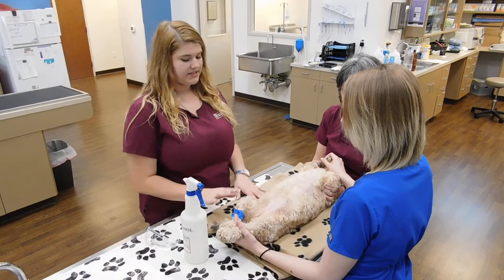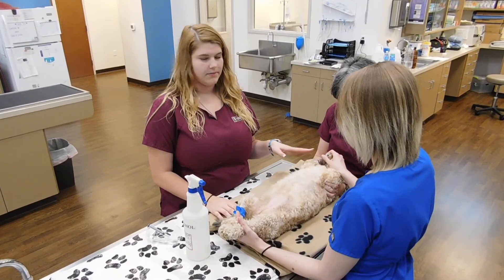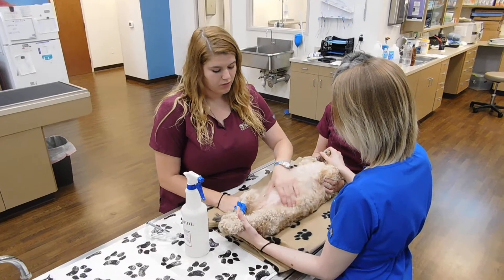Our patient is already in dorsal recumbency. One assistant is holding off the hind feet and the other assistant is controlling the head and holding off the forelimbs.